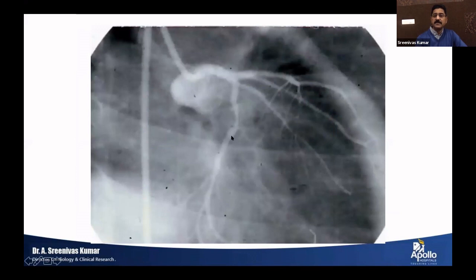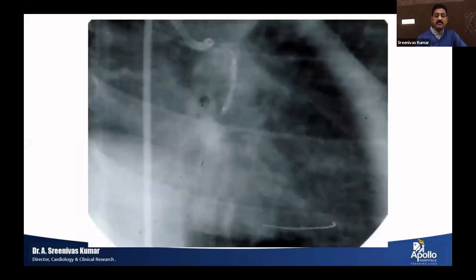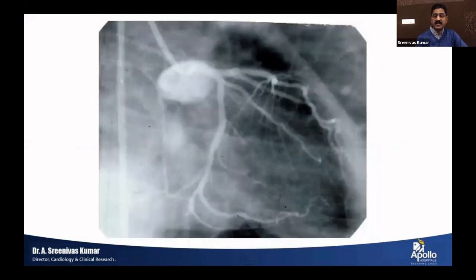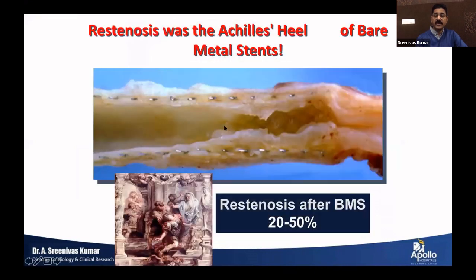This is just to recapitulate one of the first patients which we did immediately after we passed out in the carrier. This is the left circumflex artery. This was a patient who works in one of the film theaters. We still remember, he's still doing all right. Then we did the dilatations, and after that, we put a stent. That's the markers in between the stent. I think then the totally perfect result, you won't even make out the lesion where it was.